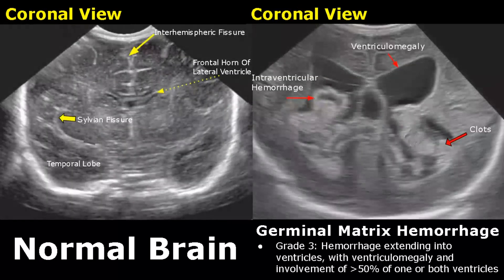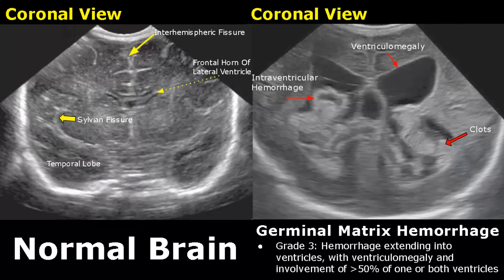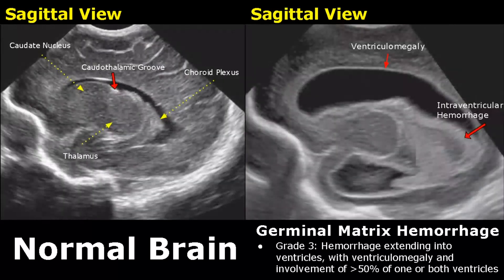In grade three, the hemorrhage will extend into the ventricles and take up to 50 percent of the ventricle, and ventriculomegaly will also be present. This is grade three hemorrhage in sagittal view — the ventricle is dilated and there is a greater degree of intraventricular hemorrhage.